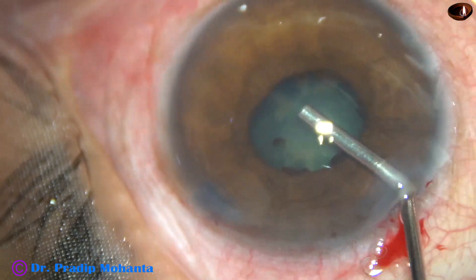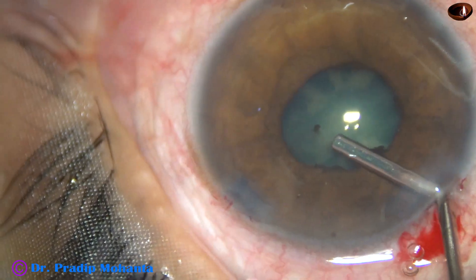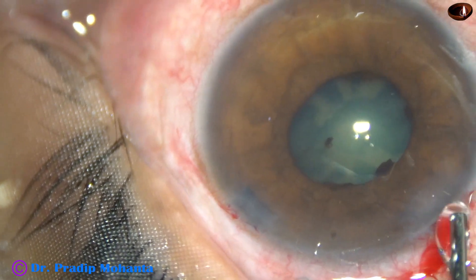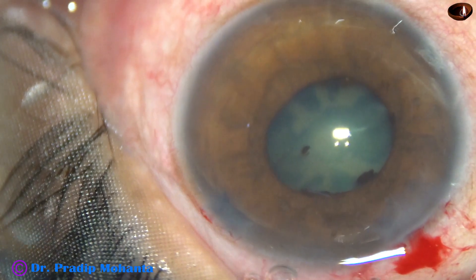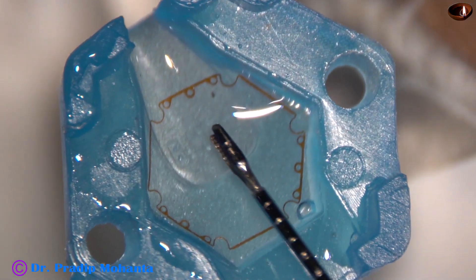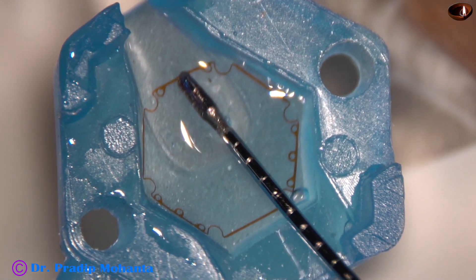The anterior chamber is well-filled, and some viscoelastic is injected behind the iris to make room behind the iris. The plan is to use a pupil expansion device. The pupil expansion device I have is the B-hex pupil expander, invented by Dr. Subhan Bhattacharji of Kolkata.